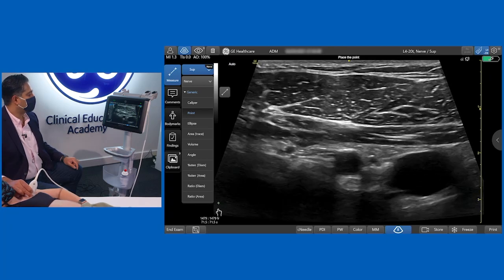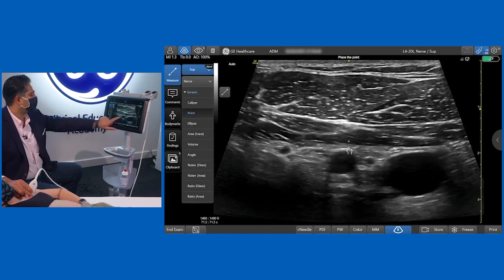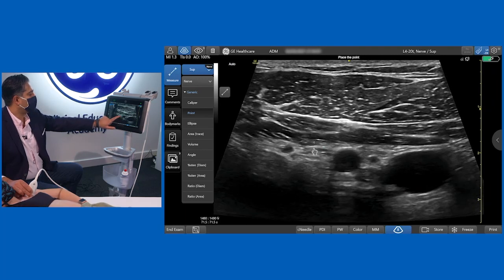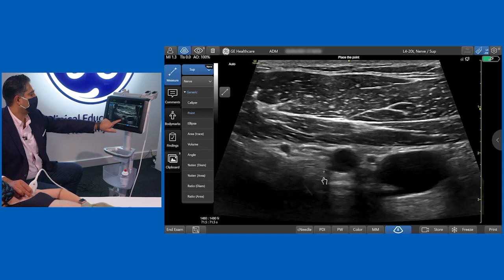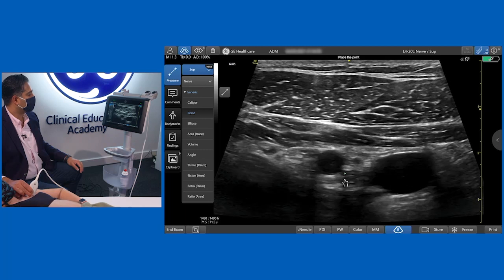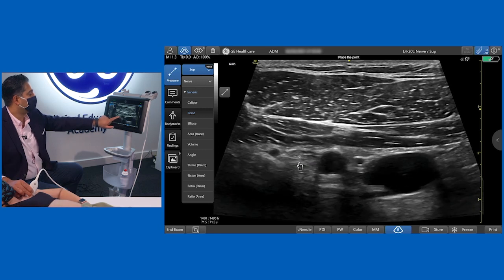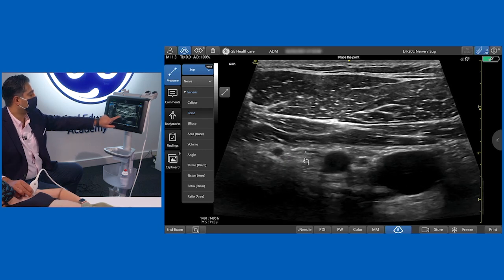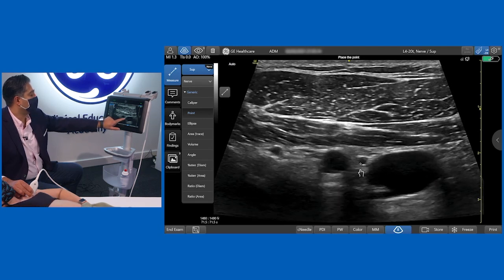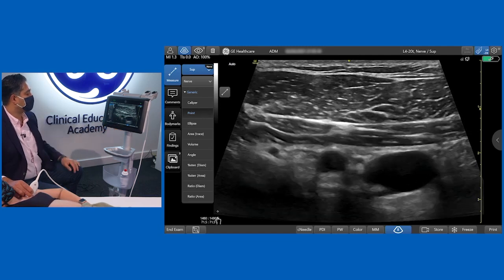As I do that, you'll start to see some really nicely visible structures. The first thing to point out is the circular axillary artery, and then we've got some hyperechoic honeycomb-like structures lying here. When performing an infraclavicular brachial plexus block, the targets are the medial, lateral, and posterior cords. Beautifully demonstrated on screen here are the lateral cord, the posterior cord lying exactly at six o'clock on the axillary artery, and the medial cord lying between the axillary artery and axillary vein.